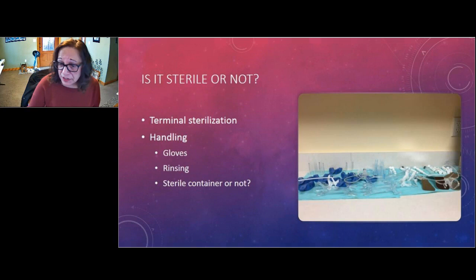If you can see this, the little tubing there is actually part of a dry field system, which by the manufacturer is a single-use device, that particular brand. These impression trays are also single-use devices. So, as I've said, what I've seen mostly in dental for items that are totally plastic like that, a lot of them are single-use devices.